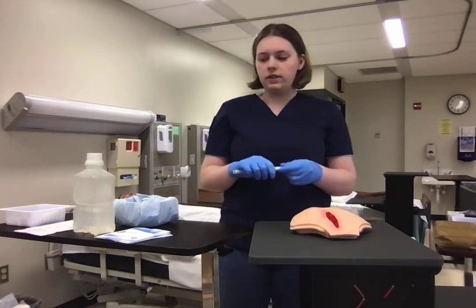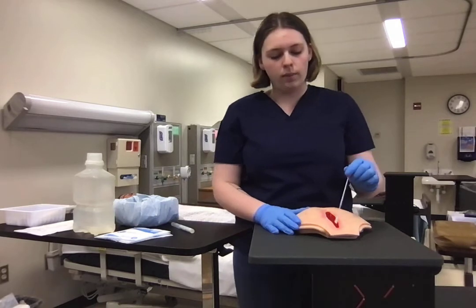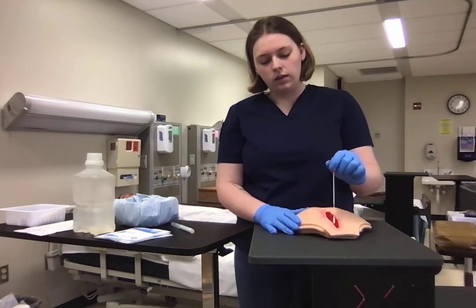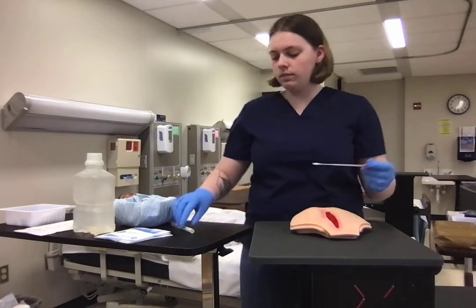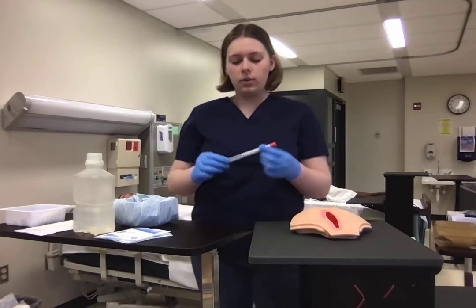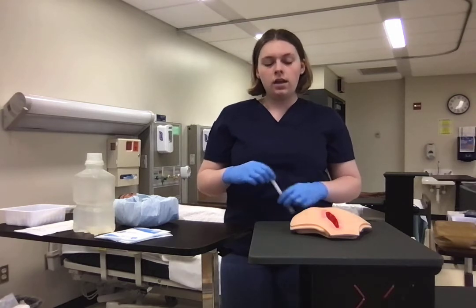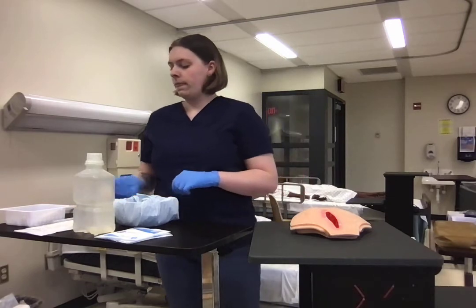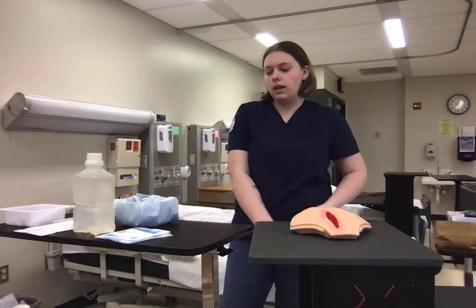I'm going to twist off the top, and I'm going to swab one side firmly, but not too firm to cause any pain to the patient. I'll swab the other side, and then finally I'll swab down the middle. I'll place my swab back in the tube, close it tightly, and then I'm going to mark it with name, date, time that the culture was taken, as well as the site. Go ahead and place that in a specimen bag and send that down to the lab. All right, and then I will remove my gloves and perform hand hygiene once again.